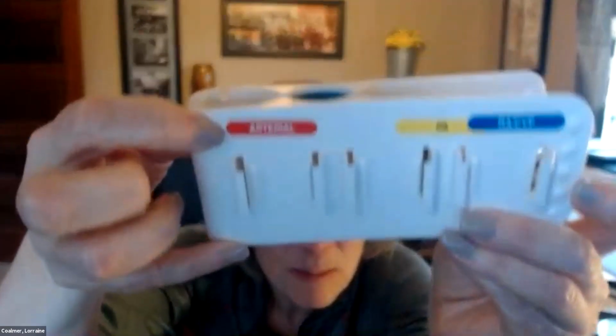As far as the lines go on the actual catheters, the arterial ones are marked red, right? For clinical, the line's not always marked red. Do you see it right here? Again, any line that I have on my patient, I follow it with my hands and I trace it back, so I make sure that, oh, that's from the artery. Let me make sure it says artery over here. So we label the lines and we try to put the transducers in those spots. Gotcha. Okay. Thank you. Anything else?